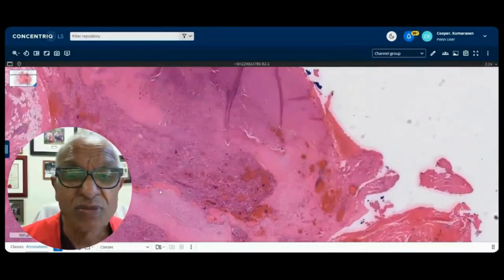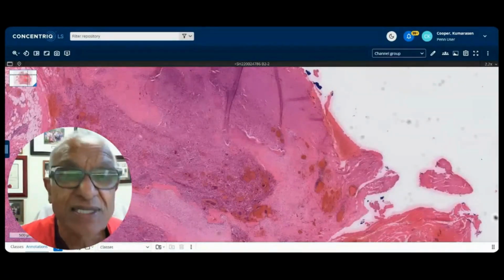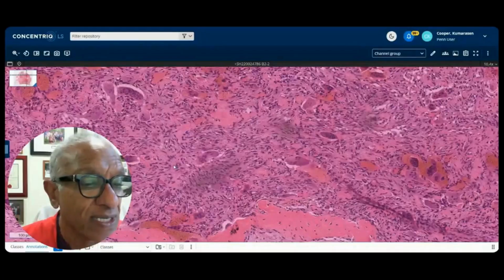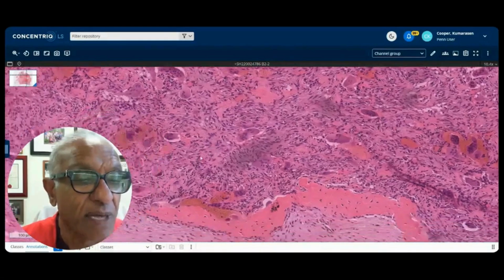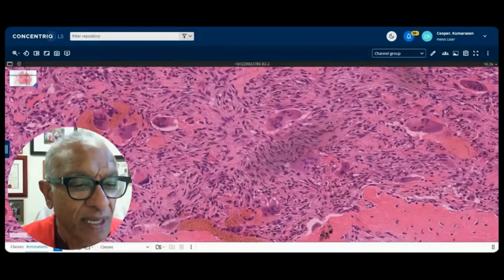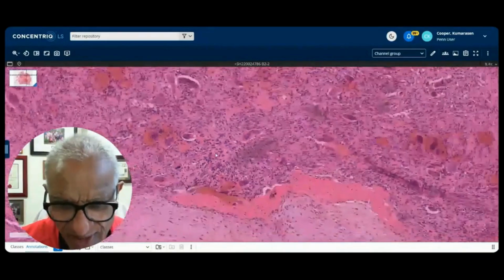Tenosynovial giant cell tumor. And so the giant cell tumor of bone, typically, again, just to come back to the morphology, these are predominantly osteoclast-like giant cells, and giant cell tumor of the bone typically has lots and lots of nuclei, many, many more nuclei. The stromal cells are very much epithelioid, and it has been said that the nuclei of the epithelioid cells resemble the nuclei of the giant cells.